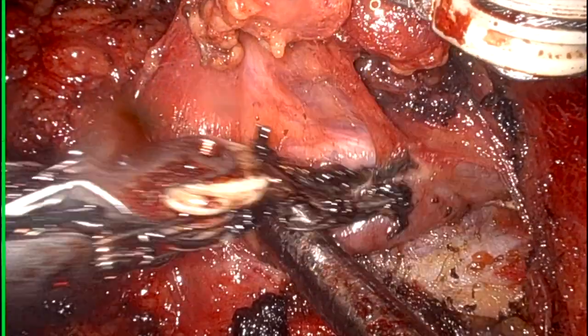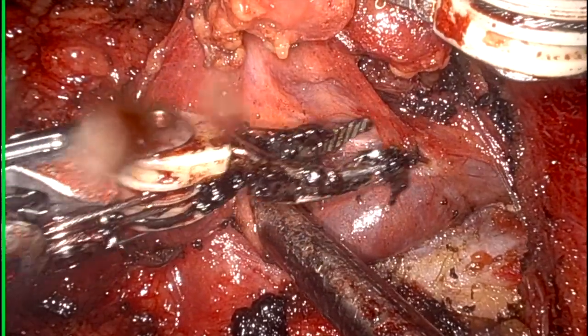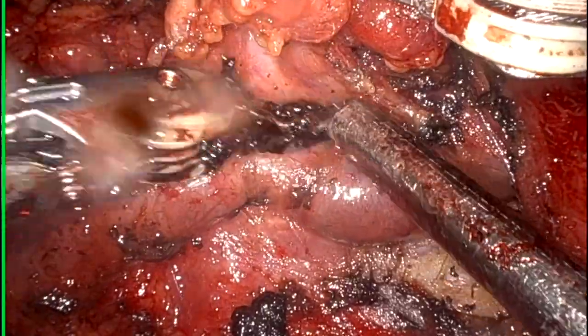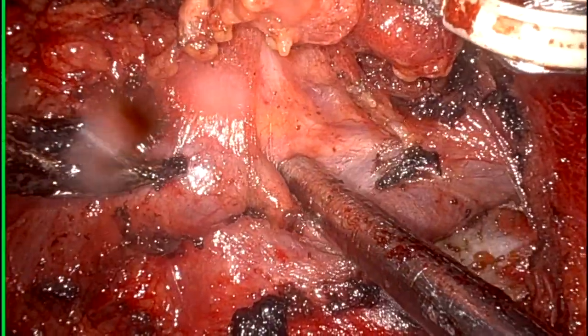So we have cleared internal jugular vein right now. And I like to clean it 360 degrees all around.